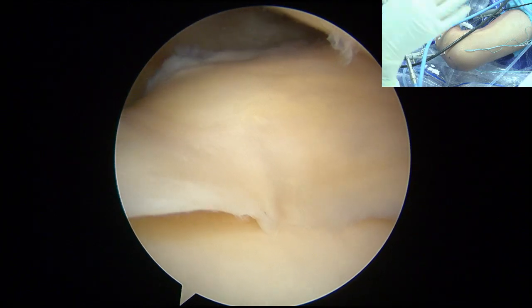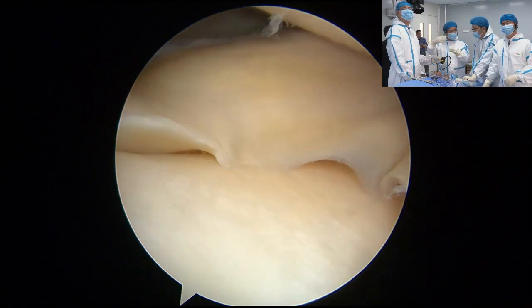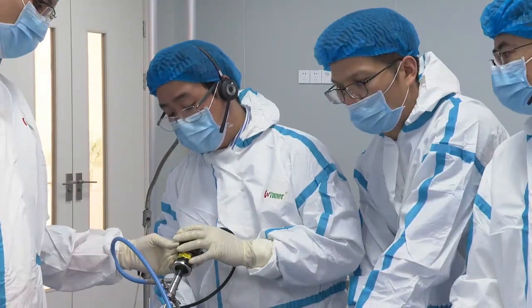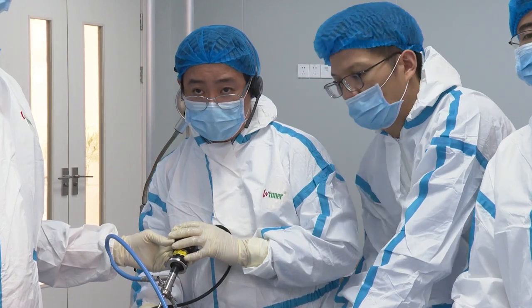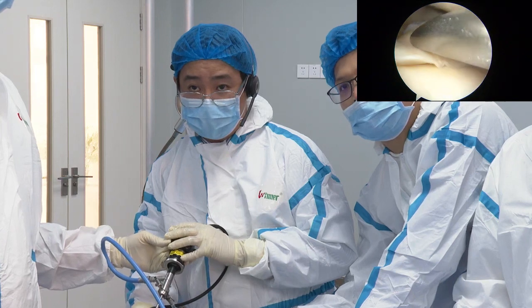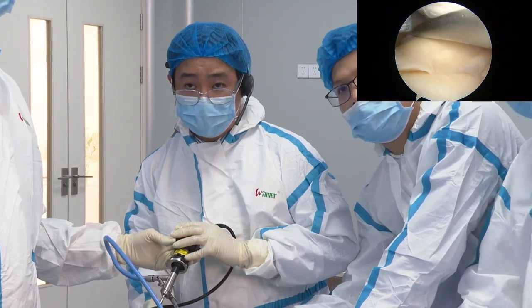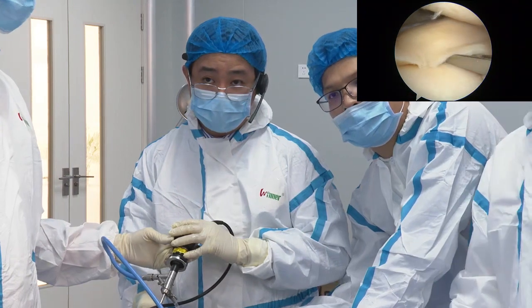Under upper surface, under upper. When you repair the upper, the under will be open, right? 那缝的时候呢，and let's say this is like the radial tear. 所以上下表面是交替操作。Okay, let's say it is always like this, right? For the lateral meniscus, you have the radial tear, okay? So now I repair this radial tear. Okay. Yeah, right. Same things, right?